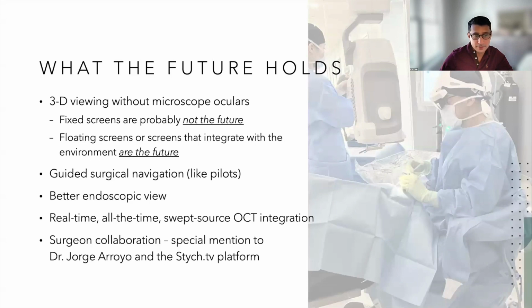We need real time, all the time, swept source OCT integration. There is a product that's out to market right now by Bausch and Lomb in collaboration with Heidelberg. And it's a beautiful product, it's very expensive, but at least they're introducing the concept of real time, all the time, OCT.